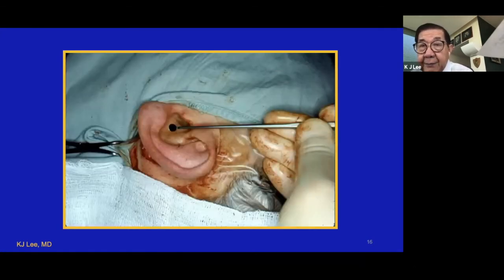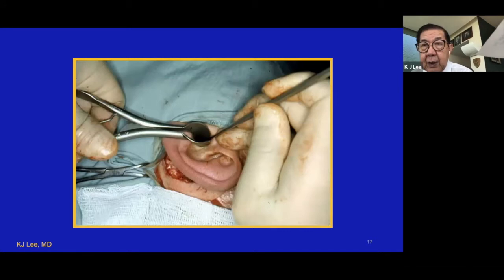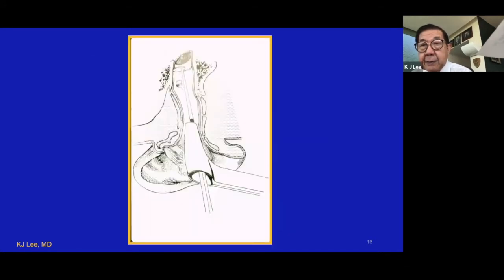And after you have done that, you use a large round knife, or whatever knife that you call it in the UK, to make an incision from so-called 12 o'clock to 6 o'clock, about 3 to 4 millimeters away from the fibrous annulus. Next. This is what you're doing now. Next. Now this is the artist rendition where that 6 to 12 o'clock incision is made posteriorly, a few millimeters away from the fibrous annulus. Next.